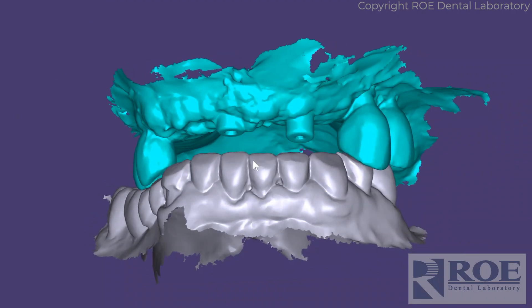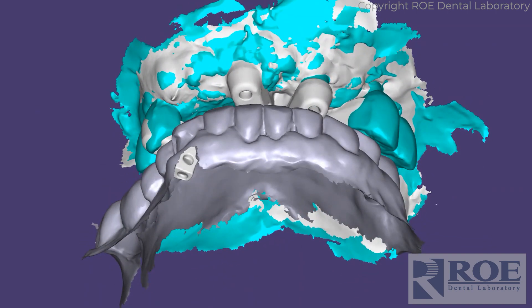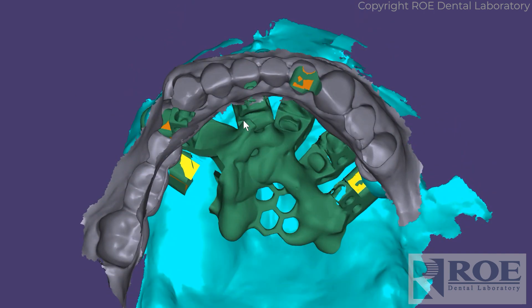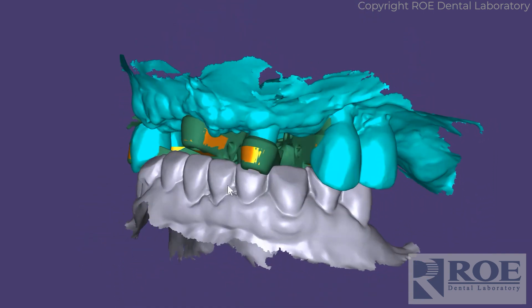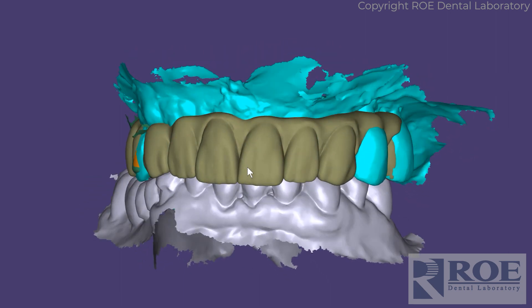This was a same-day situation, so back in the lab we started registering and stacking our files together. Based on these two teeth, we designed the restoration.